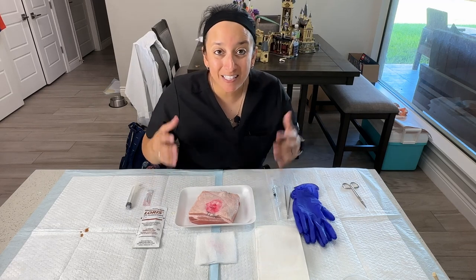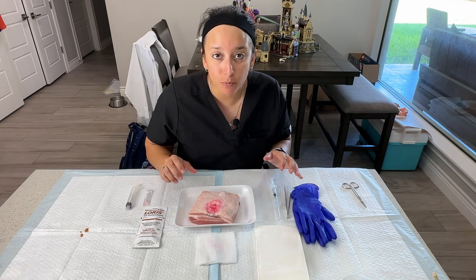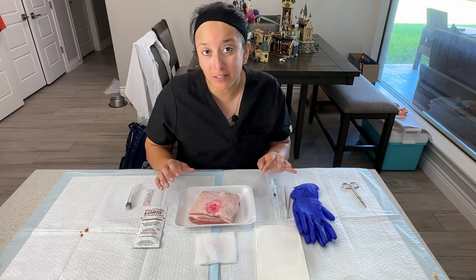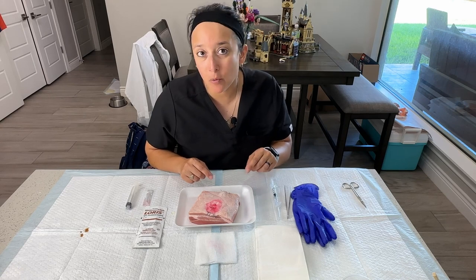Hey, Prof G here, and in this video we're going to go ahead and do a demonstration of a ganglion cyst aspiration. If you haven't checked out my video on how to create a ganglion cyst, be sure to check that out before you watch this video.